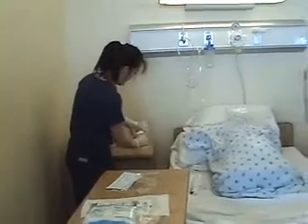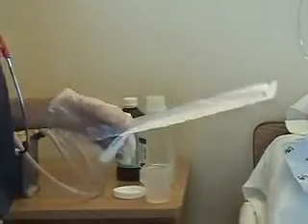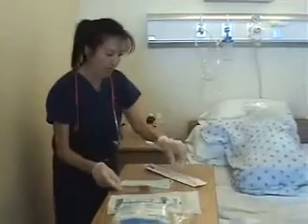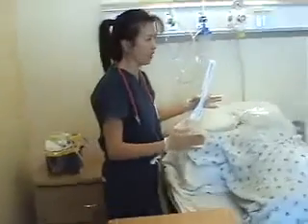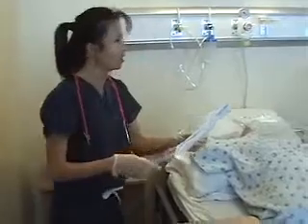I have already put some saline solution here, and I want to perform suctioning on the patient. When you do that, you do want to wear the mask, so when the patient coughs, it doesn't get onto your face. And you always want to stand on the lateral, a little bit back of the patient, so you can protect yourself, right? Do you want somebody who has HIV and TB cough on you? No.